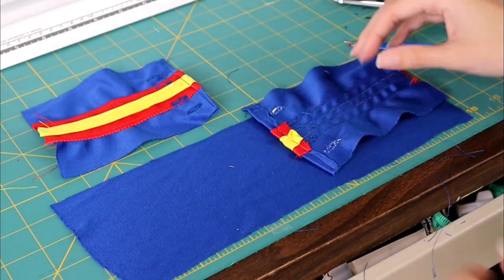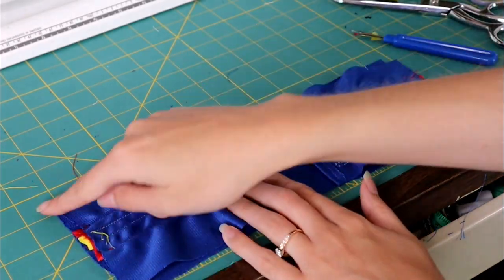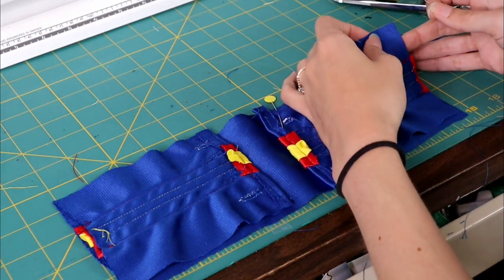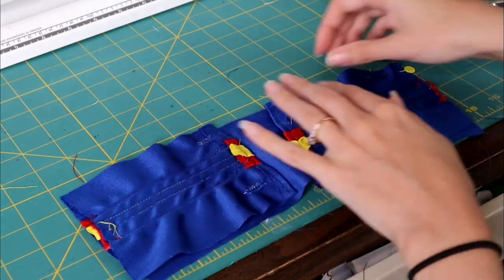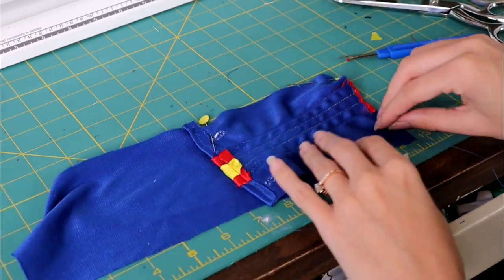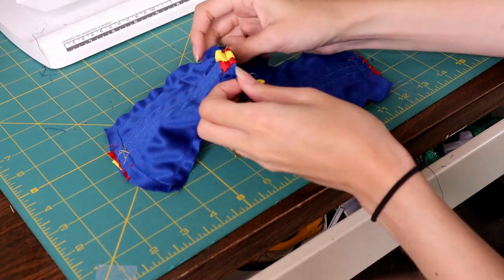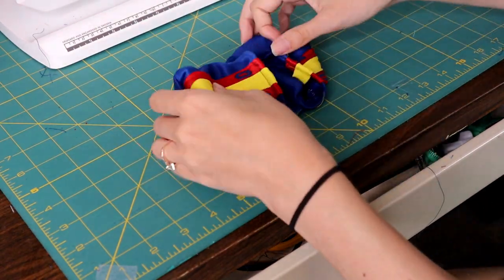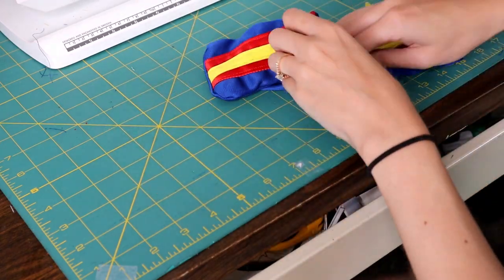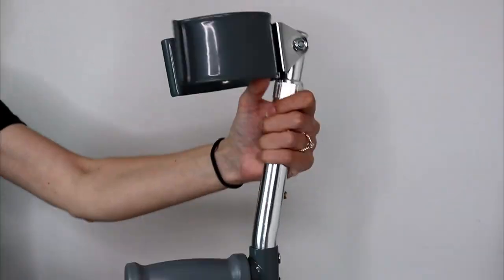Now the outside facing portion of the crutch cover is finished. We are going to sew this piece to the inside of the crutch cover, and you're really going to see this take shape now. I'm going to sew the three corners that are still unfinished, sewing them right sides together to that inside larger piece. We'll be able to flip this inside out very easily and all of our edges are going to be nice and finished — just these two little pockets.